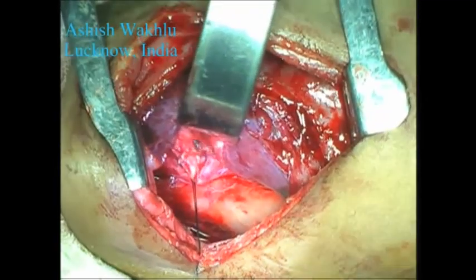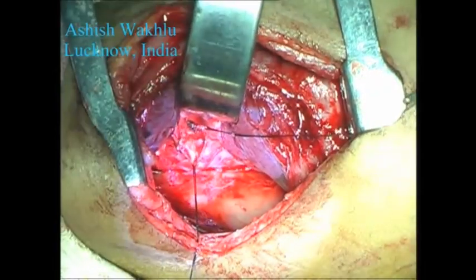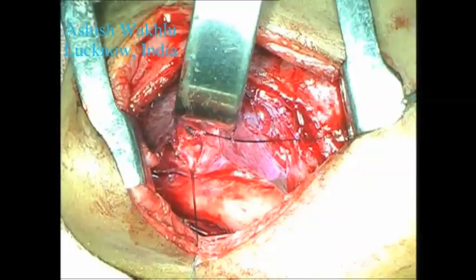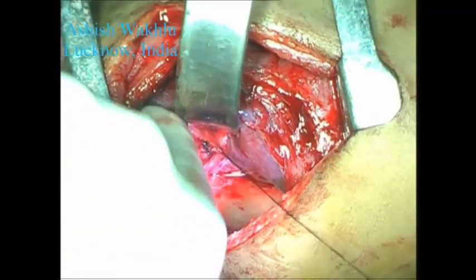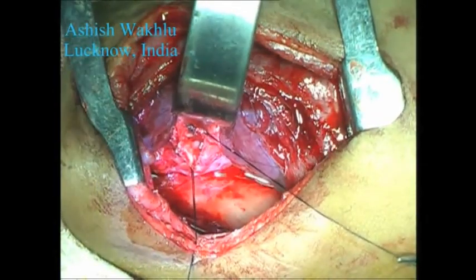At this point, we can clearly see the upper and lower openings of the right upper and lower main bronchus diverging from the tracheal bifurcation and held up in the stay sutures.